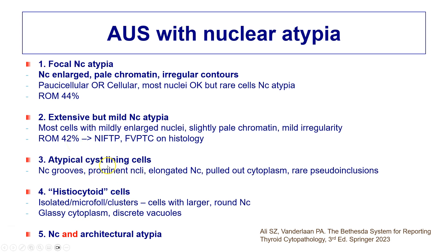We also have atypical cyst lining cells, where the nuclei can show enlargement, nuclear grooves, prominent nucleoli, and elongation. A good clue is that the cytoplasm is pulled out and sometimes tapering, and there may even be rare pseudoinclusions. These are reactive changes and are usually non-neoplastic. We also have histiocytoid cells — small clusters of cells with mildly enlarged round nuclei and glassy cytoplasm or many cytoplasmic vacuoles.